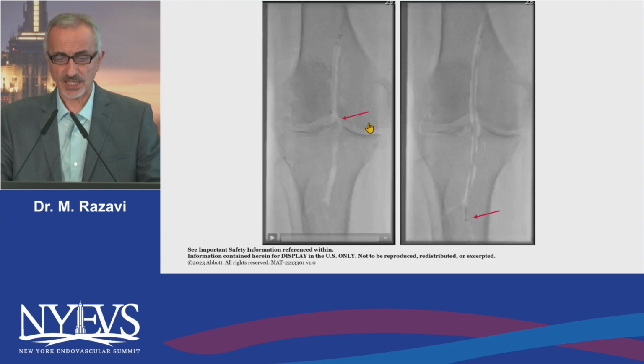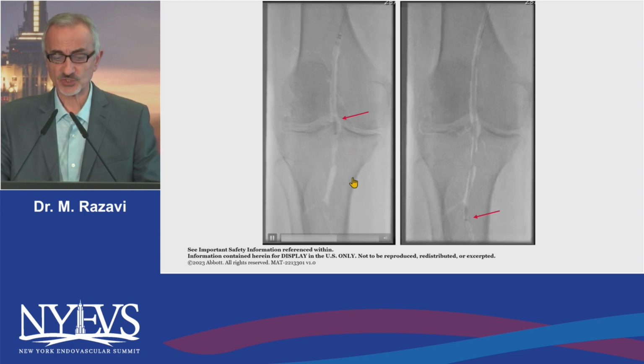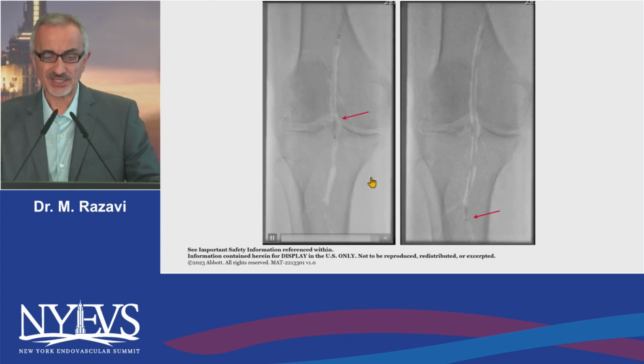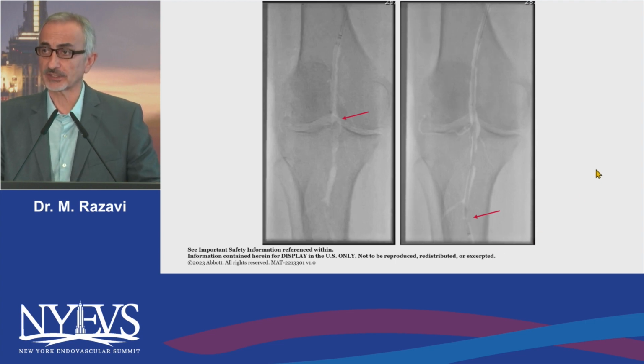And so this is live going down. As you can see, here's the tip of our sheath, here's the tip of the catheter, and this is the speed with which we advance it. Here it is, coming down. Okay, and this is over 014. We're using a 6 French 035 over an 014 system. So on the arterial side, we don't usually want to give up our access. And then this continues into the tibioperoneal trunk. And the wire went into the posterior tibial, so I took it. And so we advanced this thing into the posterior tibial.